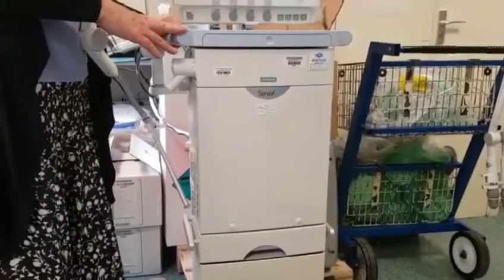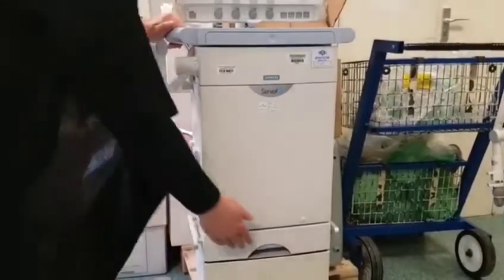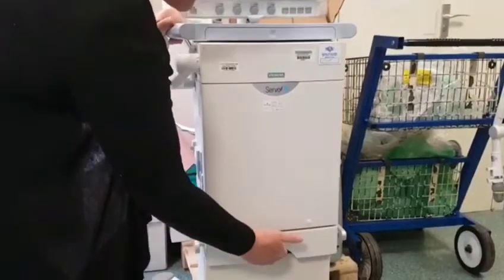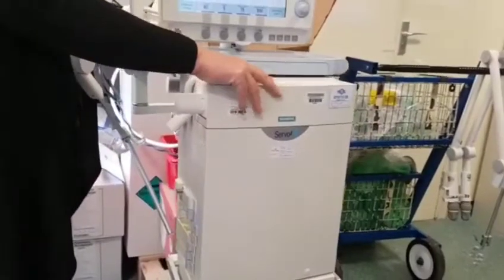I'm going to show you how to change the expiratory cassette on a Servo ventilator. You have to release the patient part of the ventilator — there's a handle down here, you have to press and pull forward, and the cassette is under here.